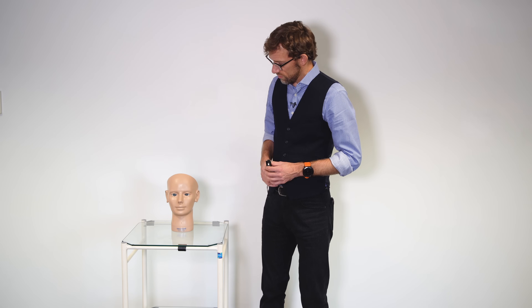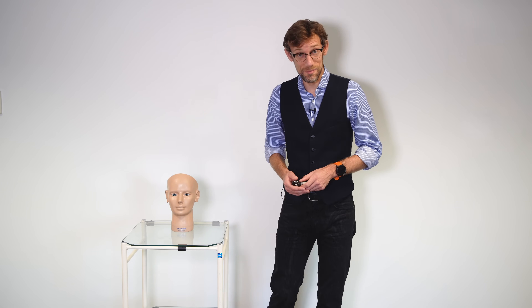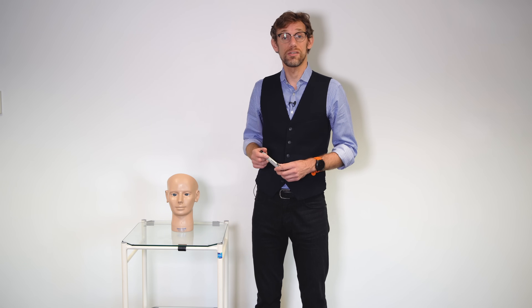With that in mind you take the ophthalmoscope and approach the patient. We want to alcohol gel our hands as we would on every consultation and then introduce ourselves. We confirmed that we were going to look at the back of her eyes, and because we're likely doing it in the GP surgery we wouldn't be dilating her eyes with drops. It is very difficult to look at the back of a patient's eye without anything to stop their iris contracting. In outpatients they'll put dilating drops in, meaning the patient won't be safe to drive, but that doesn't happen in GP very often — we still want to highlight this to our patient.